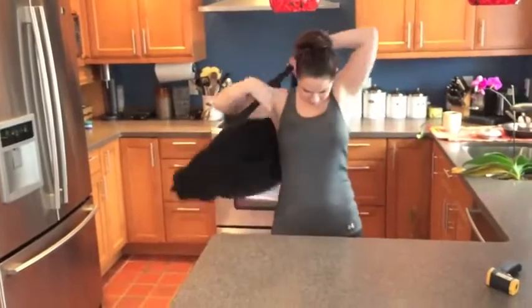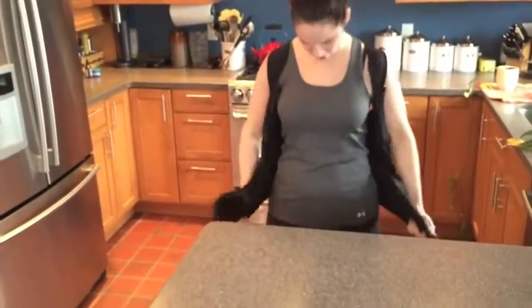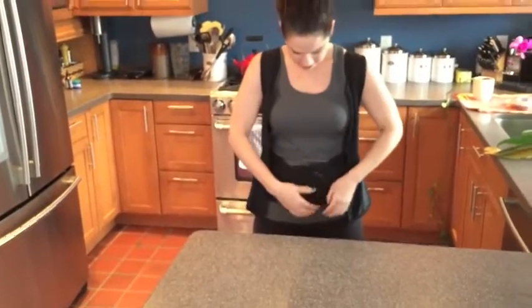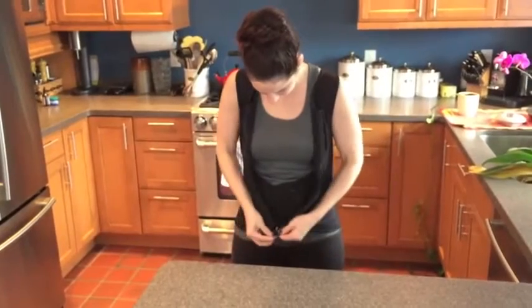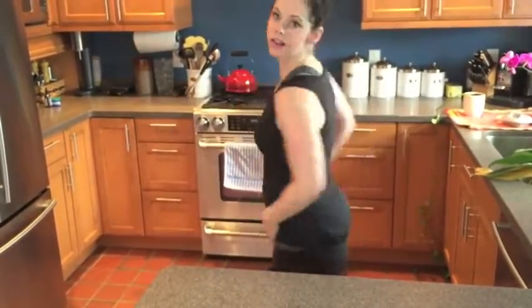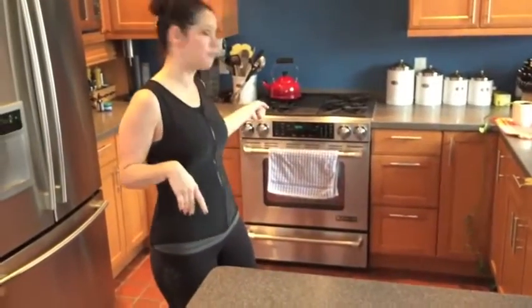Put it on. Adjust the compression strap as tight or as loose as you would like. Zip it up, and voila — here it is, nice and snug, and it's 10:43.